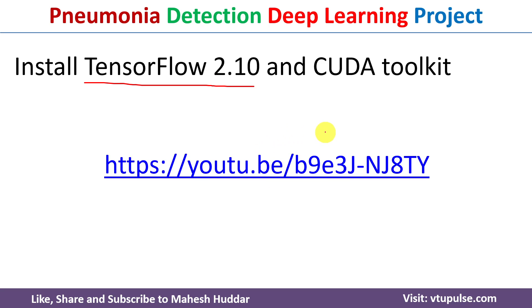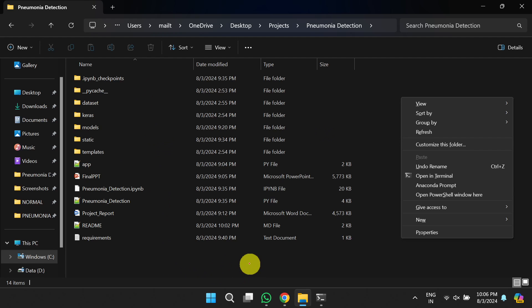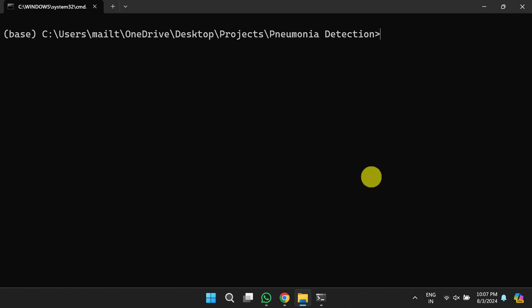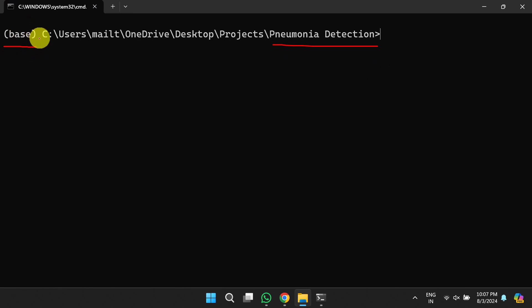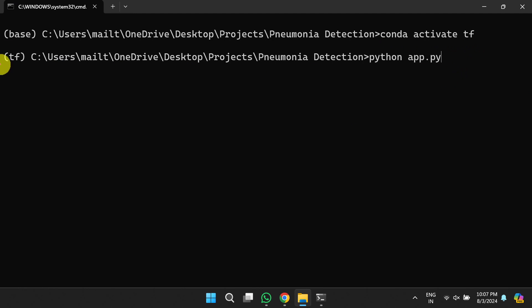Once TensorFlow is installed, navigate to the folder where you have extracted your project, then hold the Shift button and press the right mouse button. You will get a pop-up where you can select either Anaconda Prompt or PowerShell. Once you select one of these options, you will get a terminal. You can notice this is the project folder and you are currently working in the base environment. Run the command 'conda activate tf' to switch to the TensorFlow environment.